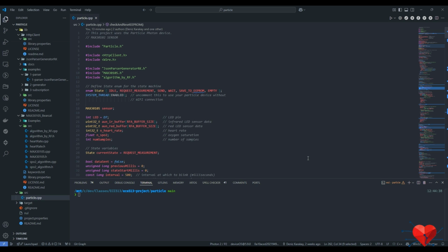So hello, today I will talk about the device side of our project. We utilize Photon 2 and we utilize the Max 30102 sensor in this portion. So I utilize the Particle VS Code add-on to write this code. We utilize the state machine.